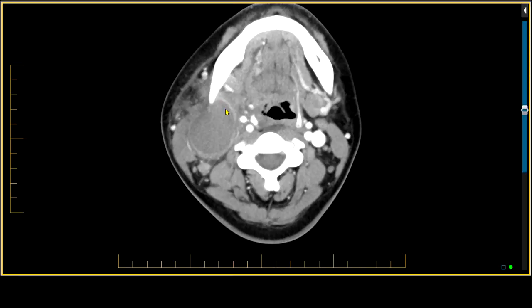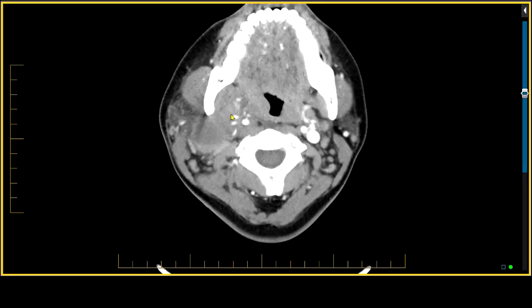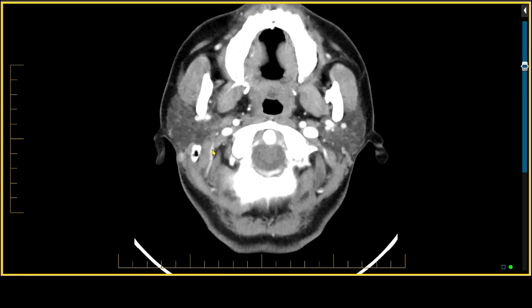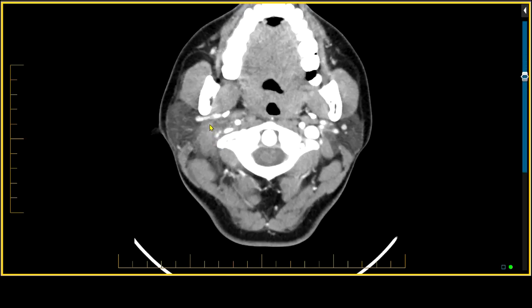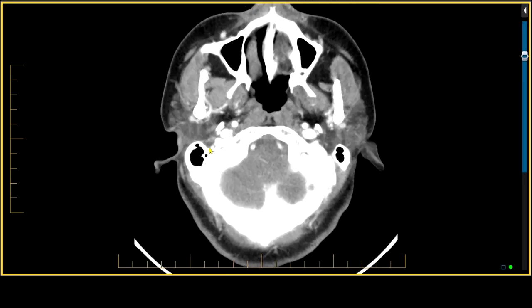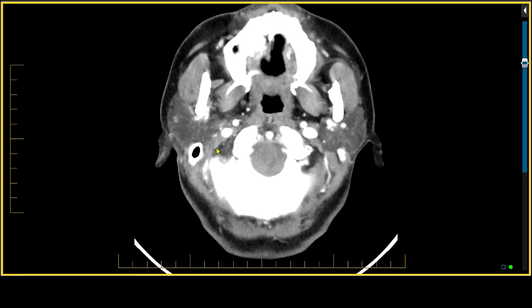Now, is this cystic or necrotic? It looks a little more necrotic based on the border here. As we scroll superiorly, we see a component appearing to go into the deep lobe or deep portion of the parotid gland. We also see tissue extending from the parotid gland posteriorly to the stylomastoid foramen — this area should have nice clean fat, and instead we have this heterogeneous swath of tissue extending to the stylomastoid foramen.